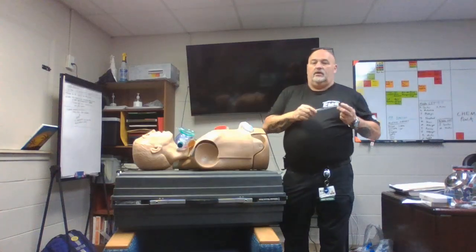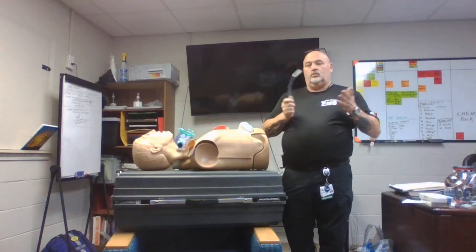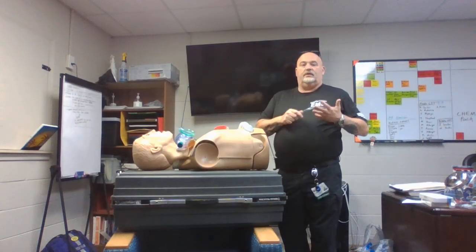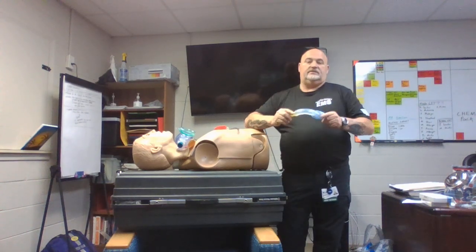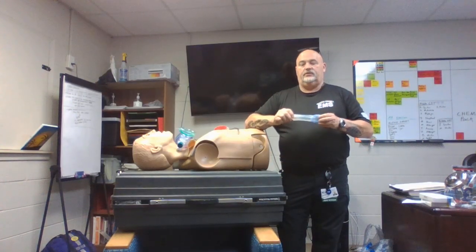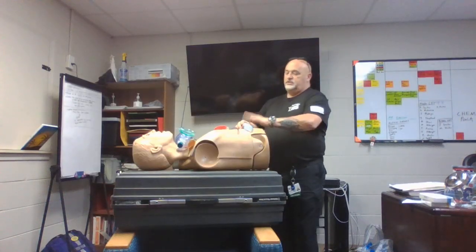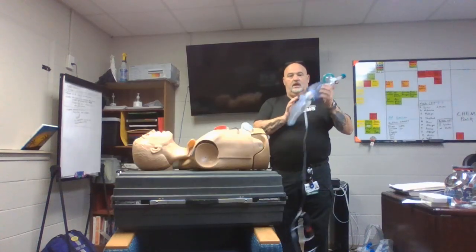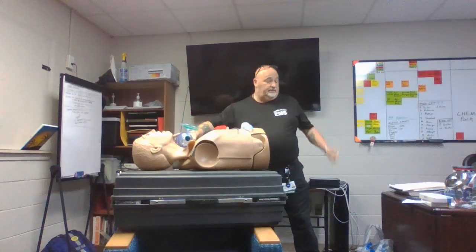The number one thing that people overlook: suction. Suction is so important. I don't care what adjunct or device you're using, we need to keep that airway as clear as possible. And we have the BIADs. These are the Air Q3s. A lot of agencies use the Air Q3 and iGel or a King. We just use an Air Q3. And of course, the basic of the basics, a bag valve mask.